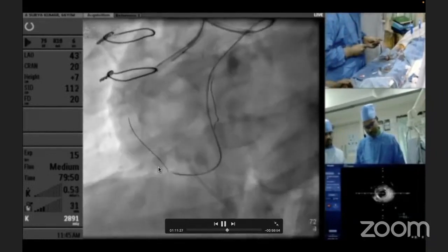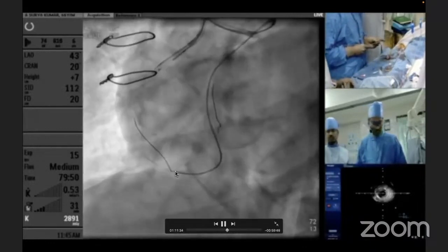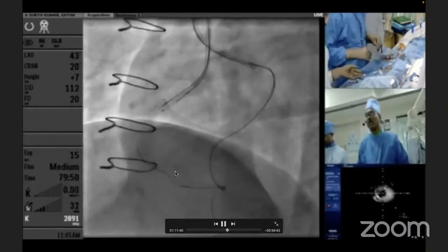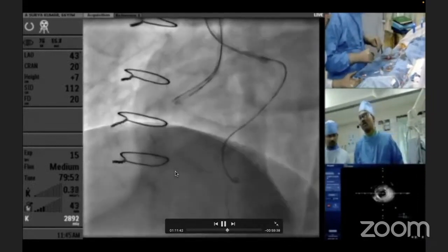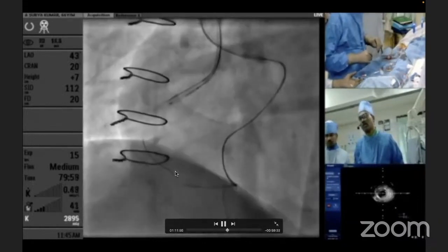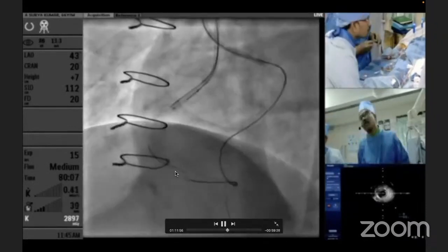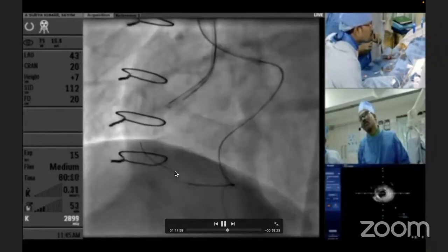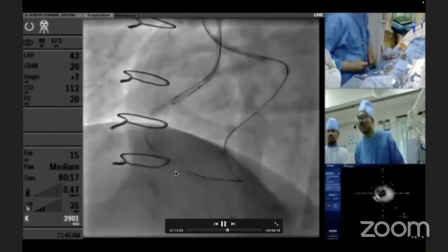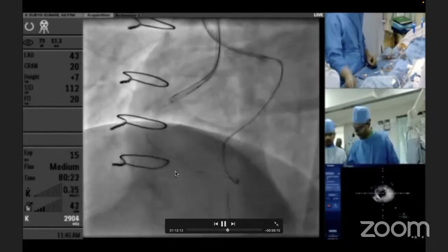And you can as well see the wire is taking a loop just before the crux. The antegrade wire is taking a loop. That is because of the graft pulling your native vessel towards its course. You can even appreciate it here. That complicates things. The moment I understood this part, I thought of trying for some time, but I realized I have to take investment in this case, keeping radiation in mind, and not much contrast. We have not given much contrast here. But radiation, Mic fatigue, team fatigue.